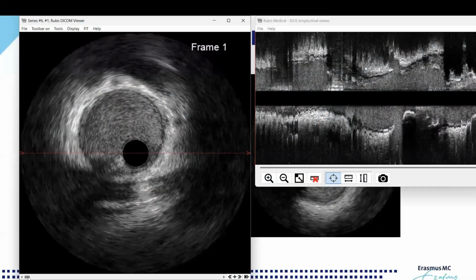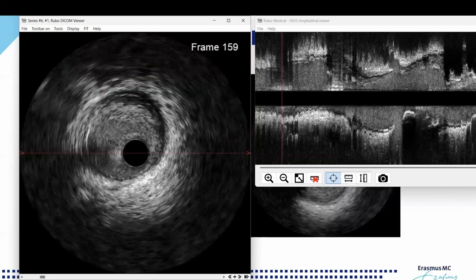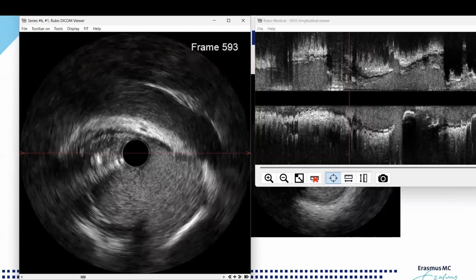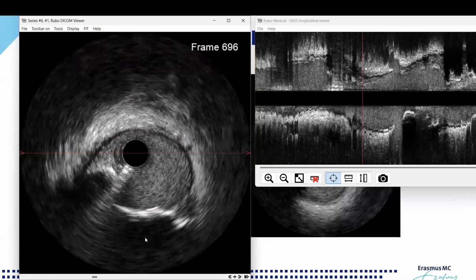Well, let's see the IVUS pre for the LAD. We start in the distal LAD, and very often the distal LAD is quite normal. We have here some intimal thickening in there, but this is always quite nice. And more proximal we see here an example of, again, fibrofatty plaque, darker than the surroundings. And also here more proximal in mid LAD, we have again eccentric superficial calcium without reverberation, by the way.